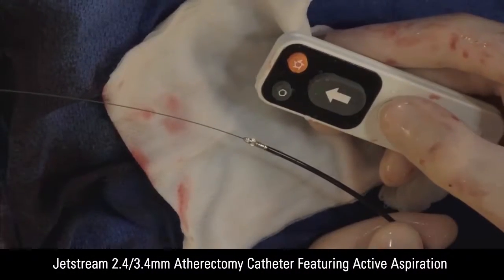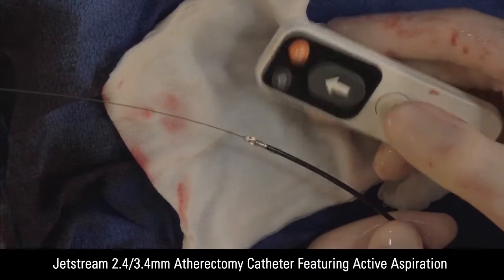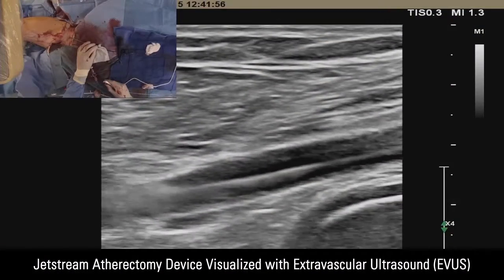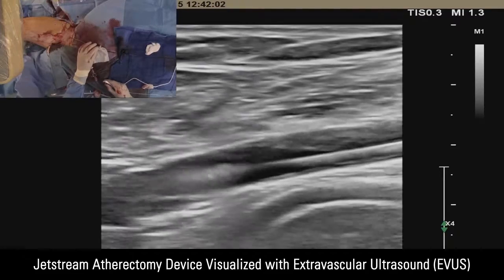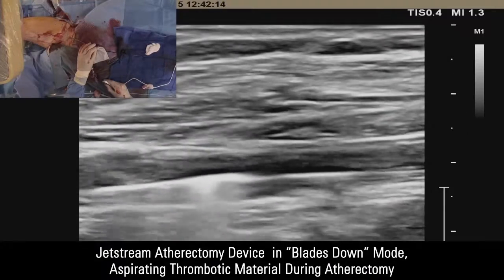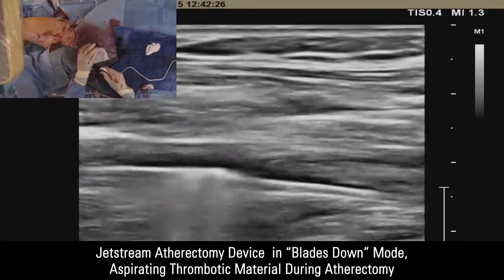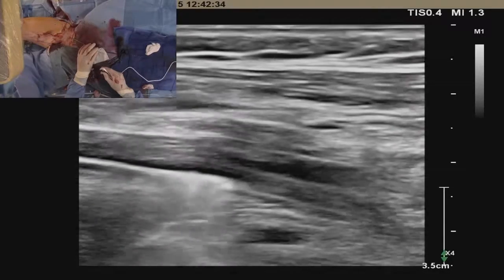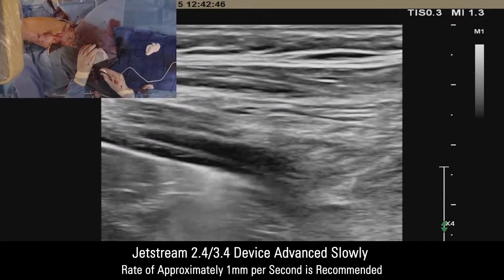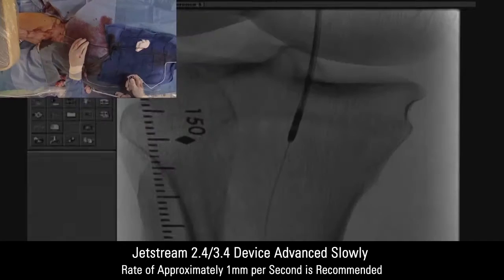The image displayed here shows the atherectomy JetStream System 2.4/3.4 mm device. You can see the unique feature of this device with aspirational capabilities plus atherectomy capabilities. The device is currently being activated and you can see the mechanism of action under extravascular ultrasound. Atherectomy can even be performed with the blades of the device in a down position while we're aspirating the thrombotic component of the plaque. The device is being advanced slowly — you ideally would like to advance the device in 1 to 2 mm bites and take your time.